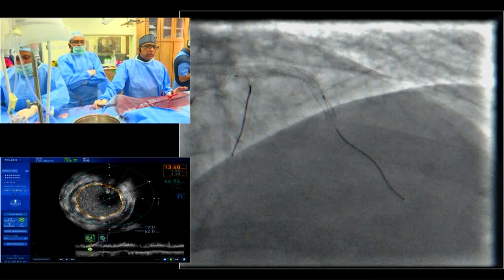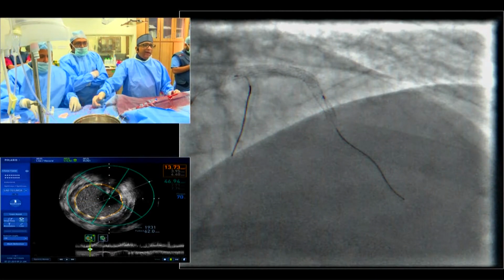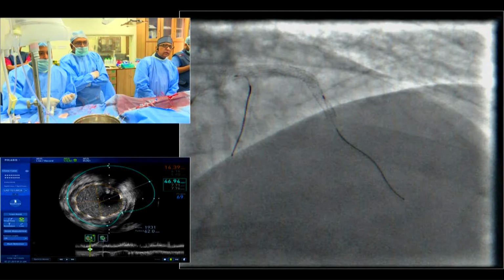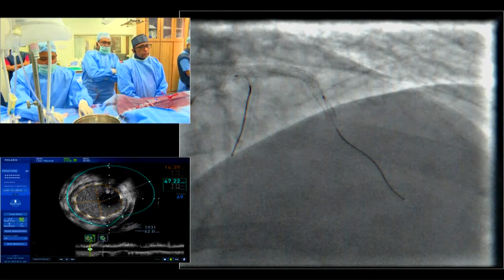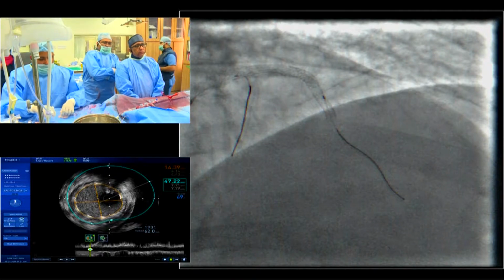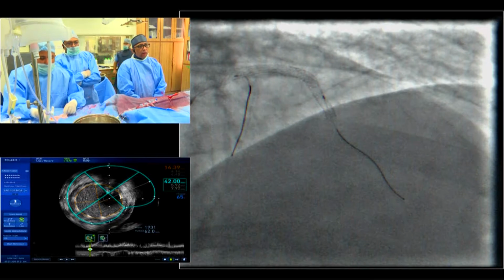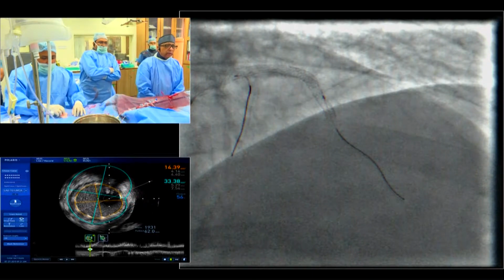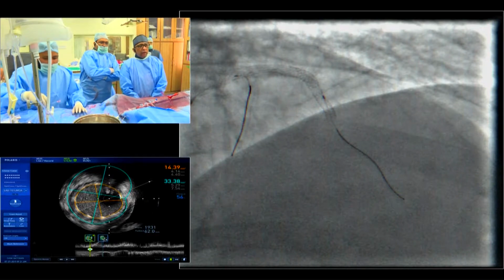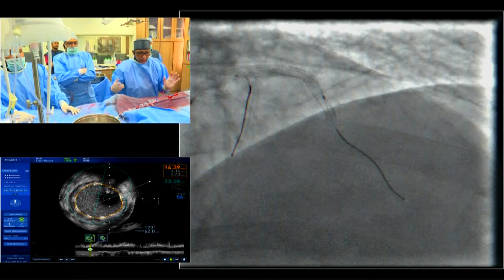It's 13.6. What else? Actually, no, 14. No, actually it is 14.39. So if the area is good, even if the stent is hanging, it is very good. Yeah, it's perfect. And also, I won't go further. It is enough, I think. If I can achieve the area, I think it is enough.